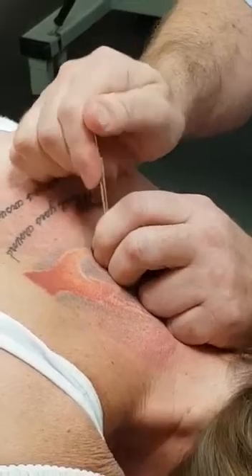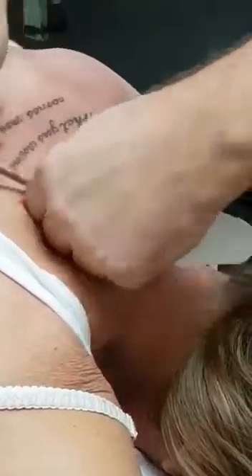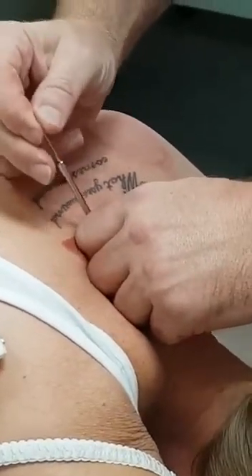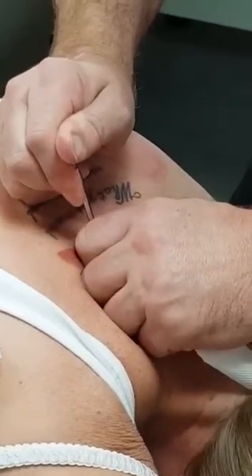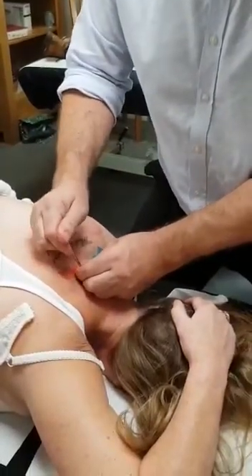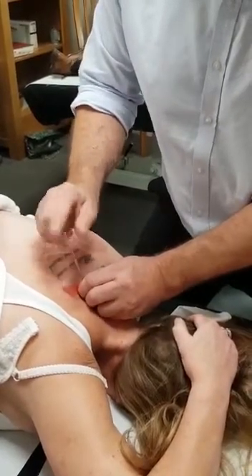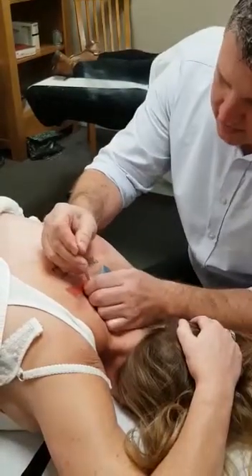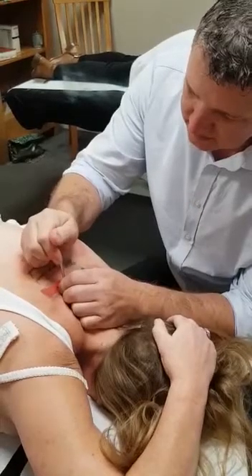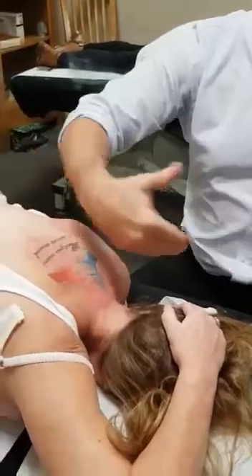It's called the gun IMS technique. She lets me know when we hit the really fibrous thick bits — there's a point on this side as well that you can see. We come in, lock it down so it can't move. Just really thick. You can see it in there. It's hard, this is really thick. Here we go — you feel it starting to give and then it gives away, good, and then that's coming out. All about safe angles, all about making it a safe technique.